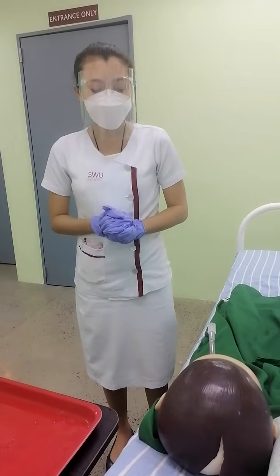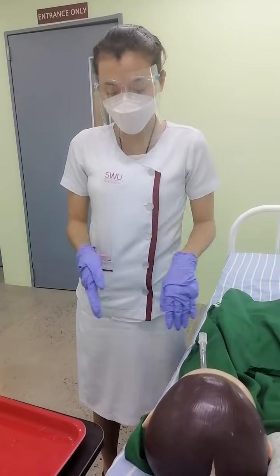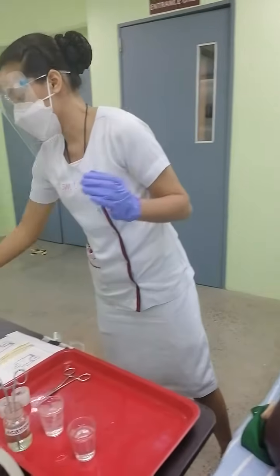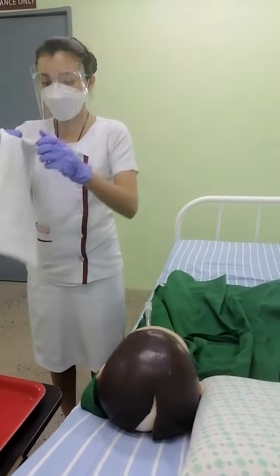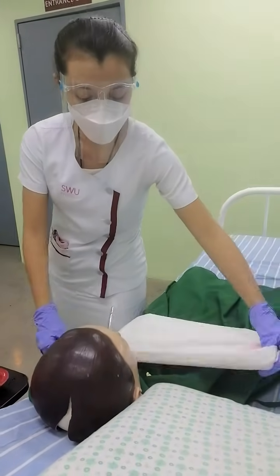After which, I will position the patient properly in a comfortable position and then cover the patient's chest with a towel. The purpose of covering the patient's chest with a towel is to protect the patient from oral secretions while doing the procedure.